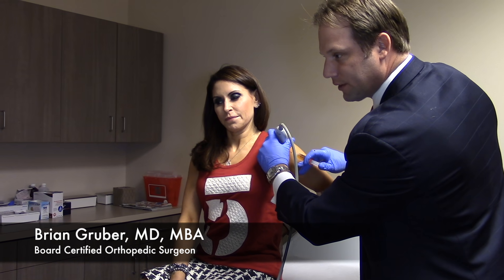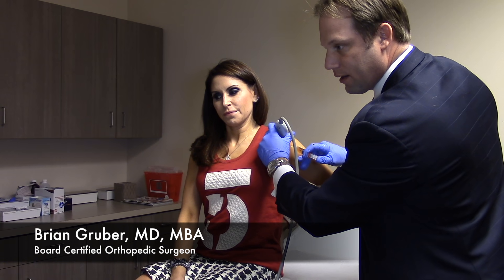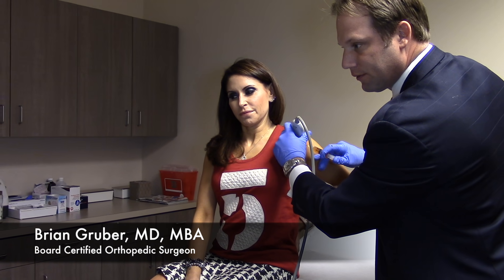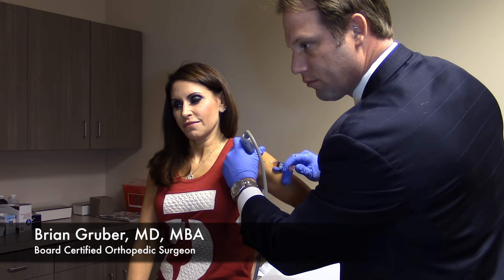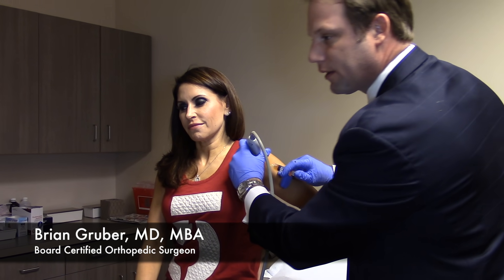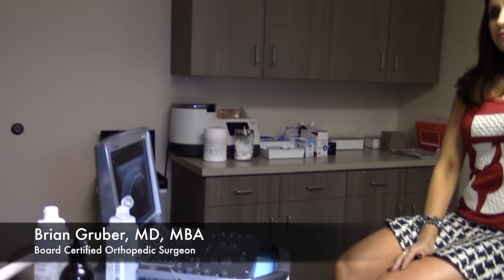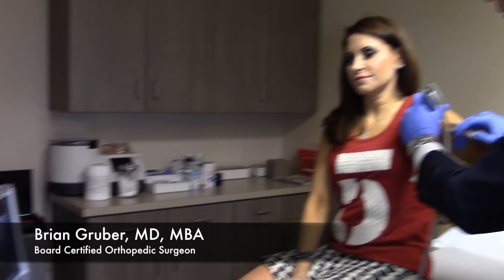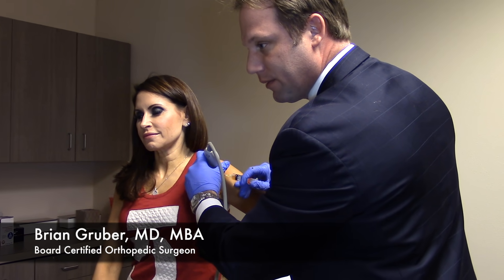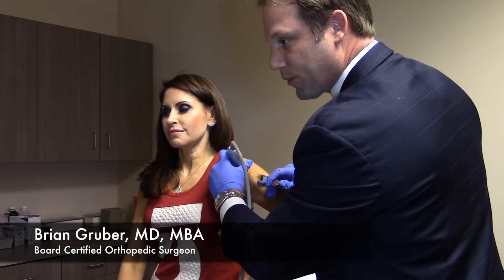With the ultrasound I can actually visualize the needle going in and out of the tendon in the area where we need to put the medication. The ultrasound has really helped advance the practice of PRP and all the biologics — before ultrasound you had an idea where you were putting things but not exactly. The ultrasound allows you to be very precise, not only with PRP shots but with other injections as well.